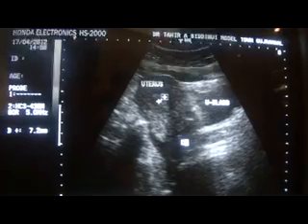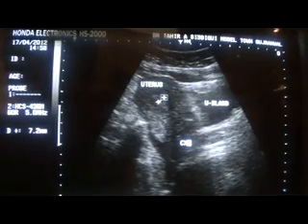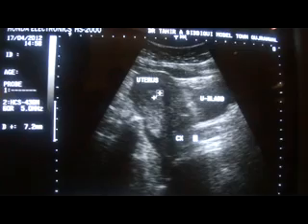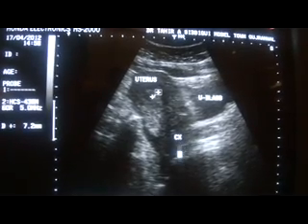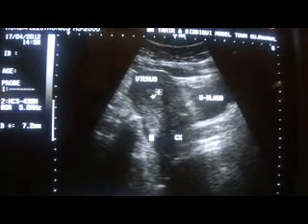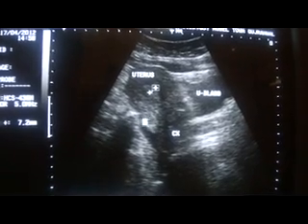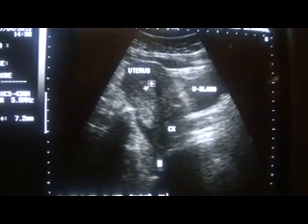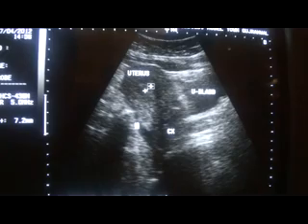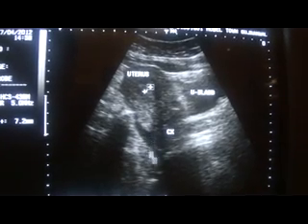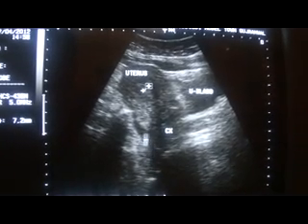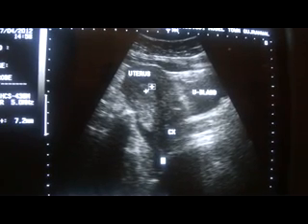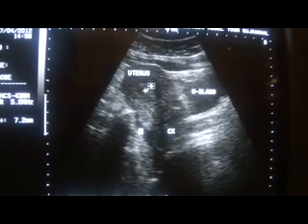And in transverse section, we still see fluid. This is the transverse view of the uterus and this is the fluid. Fluid is present. This is the transverse section, and this is in the longitudinal section — fluid.